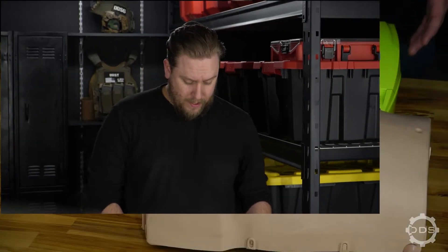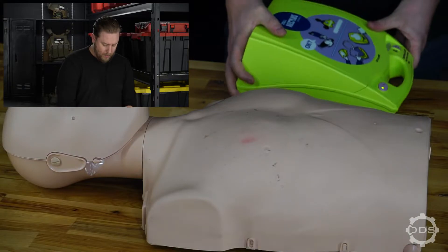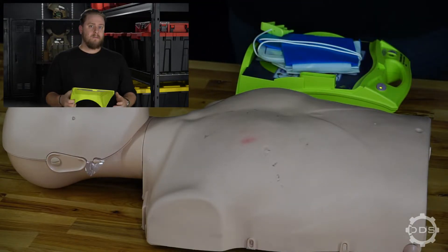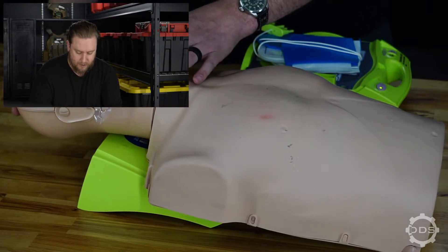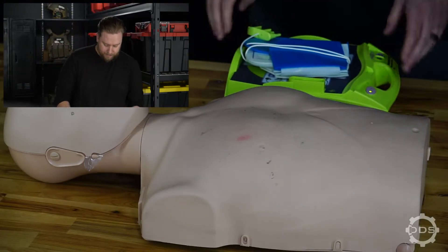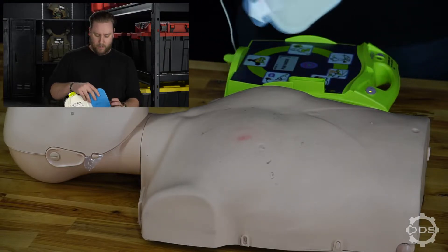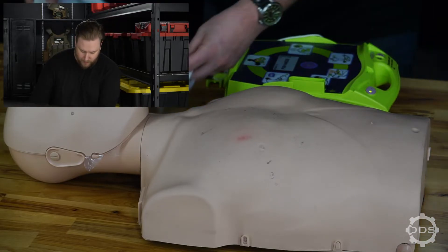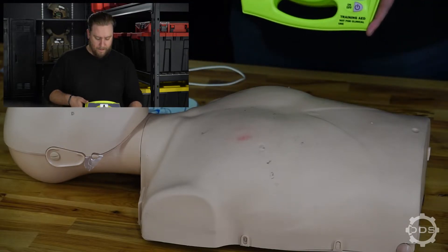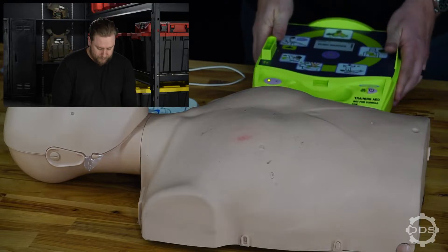Let's break down using an AED and its automated instructions. Here we have a Zoll training AED, a very common brand you'll see around a lot of workplaces. The first thing we do is remove the lid — the lid can actually be used as a propping device placed underneath the patient's shoulder blades to help open the airway in a head tilt chin lift position. The unit also includes the pads, which on this model are all connected as one unit, making it straightforward and easy to use. The AED itself gives automated audio instructions as well as visual cues.